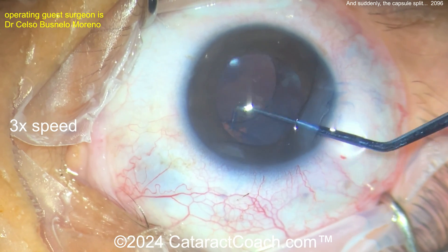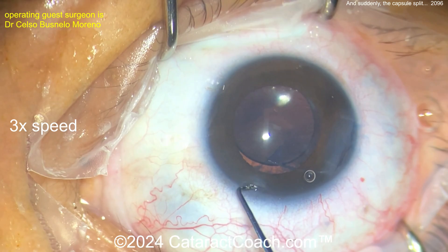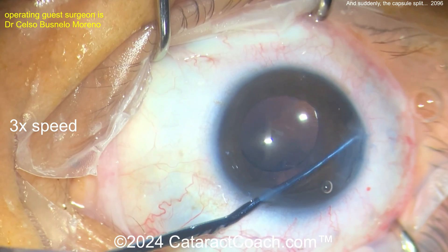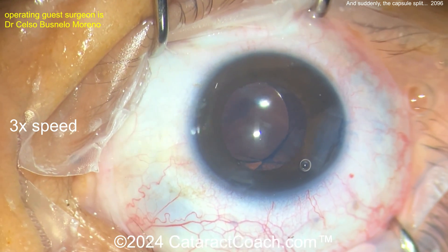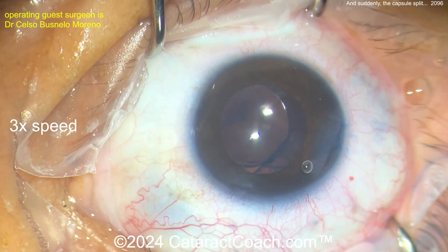There's the L — looks good, there's the optic, there's the L, the trailing haptic looks like a capital letter L. So the seven-L rule. Get some more viscoelastic. Be cautious about dialing the lens around too much because you can rip the capsule even more. Now getting that trailing haptic — using the chopper, getting it from the angle and putting it in the sulcus. There you go.